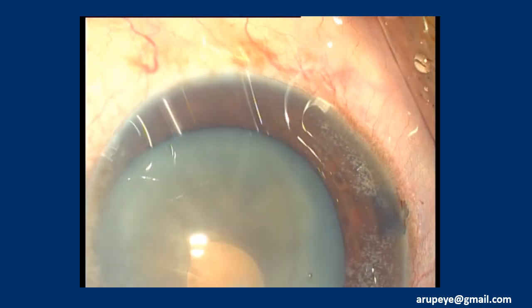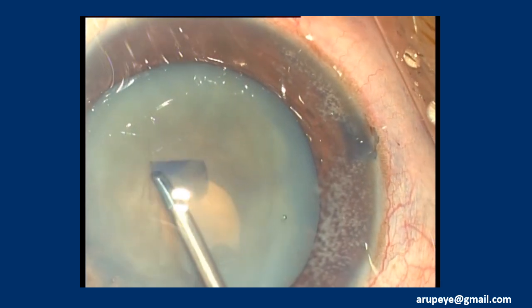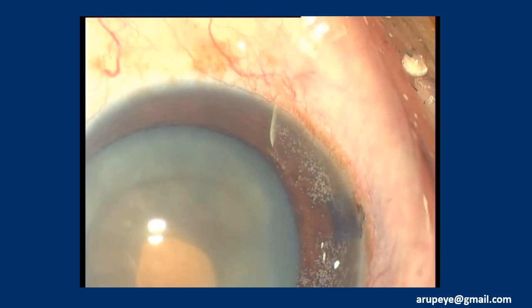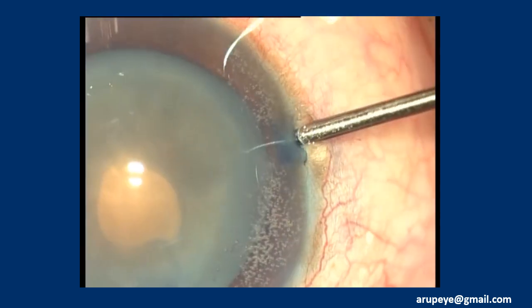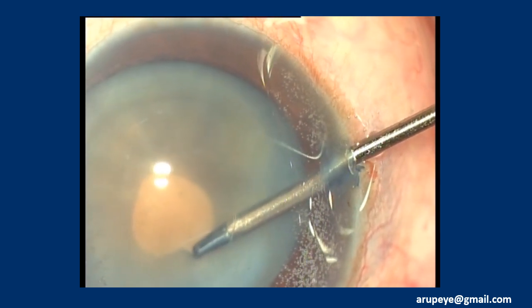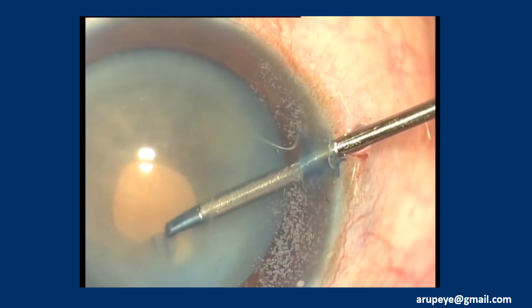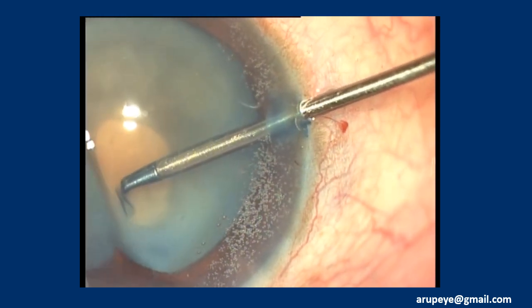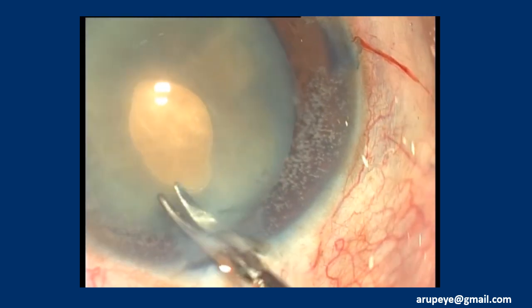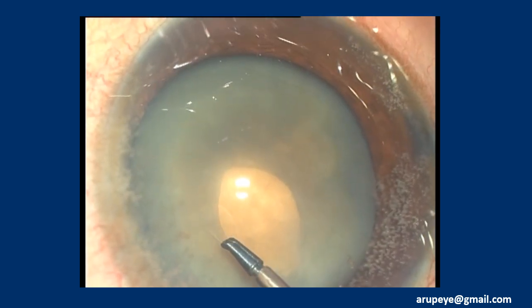As you will see here, the nucleus is freely mobile and pretty large. I would prefer to have the rhexis sized between 5 and 5.5 mm in diameter. Anything less than that would mean increased stress upon the capsular-zonular apparatus while manipulating the nucleus within the capsular bag. The desired size rhexis is achieved here in multiple stages. The surgeon should be adept in handling both the micro rhexis scissors and the forceps working from the side port incision as well as the main incision.